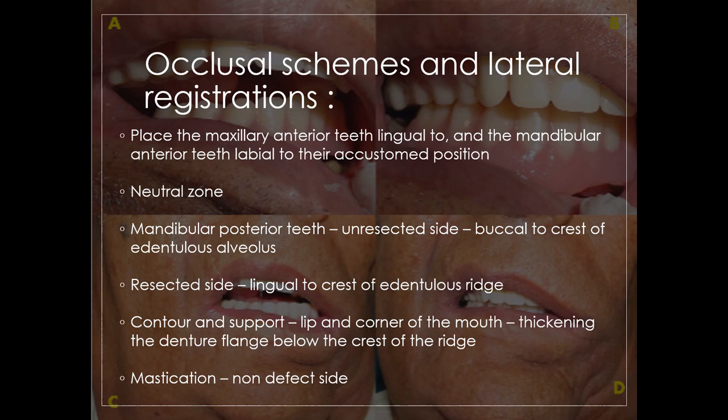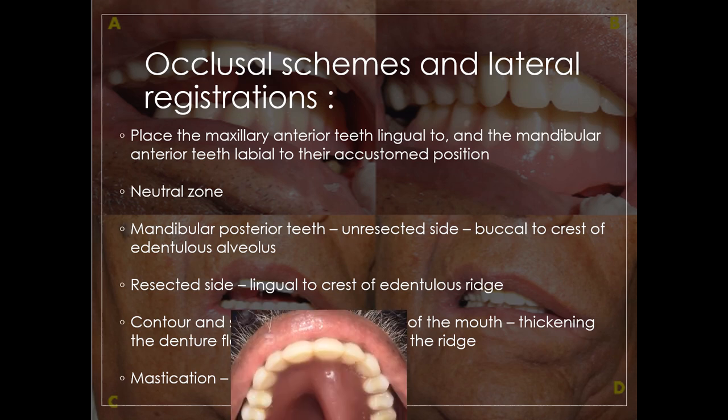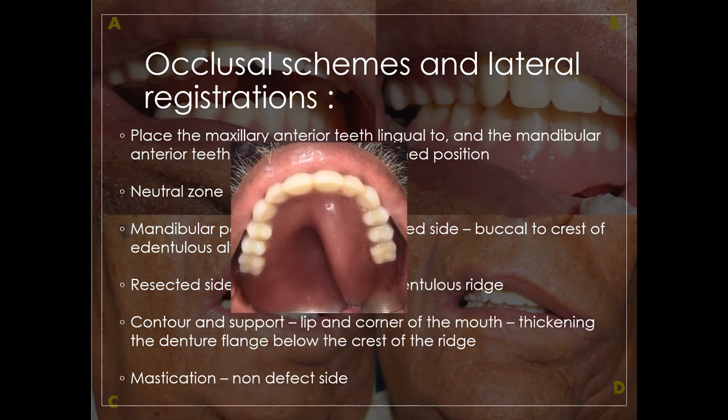So there is an abnormal profile if you view from the frontal plane. And after all the mandibular teeth and maxillary anterior teeth have been arranged, ramps are developed for the maxillary prosthesis in base plate wax. We have already discussed these guidance ramps in our first session.